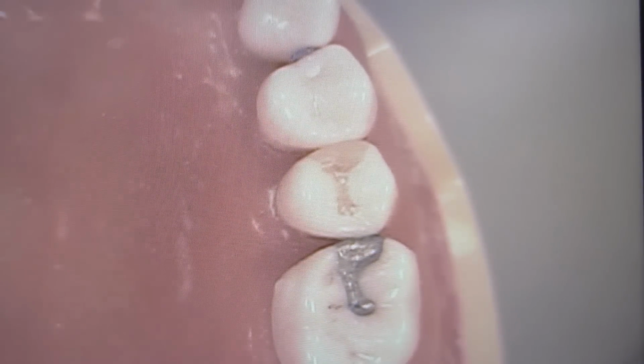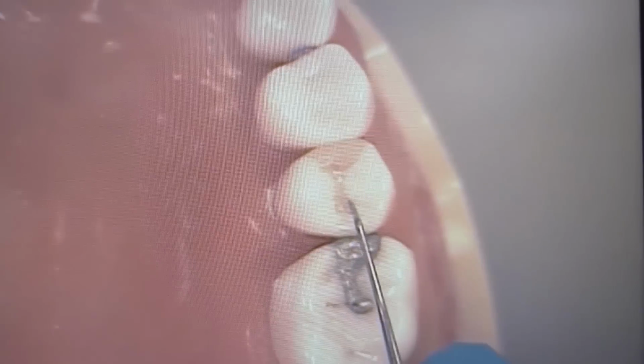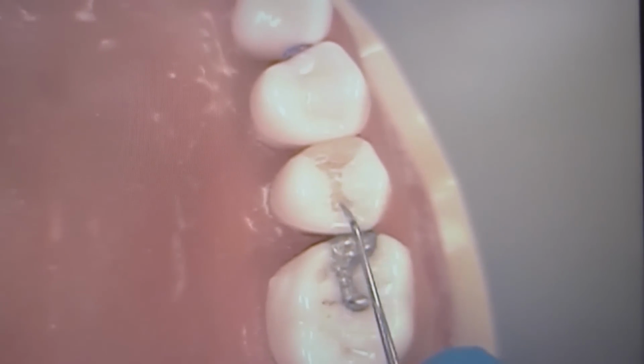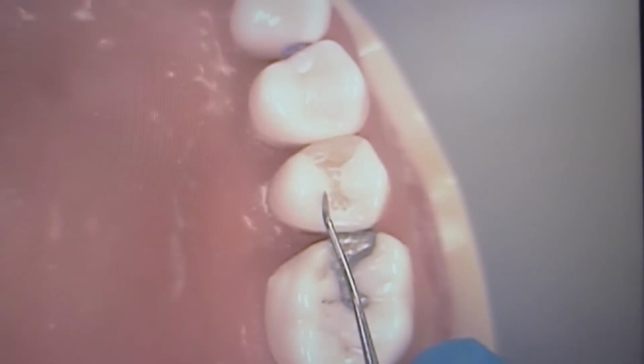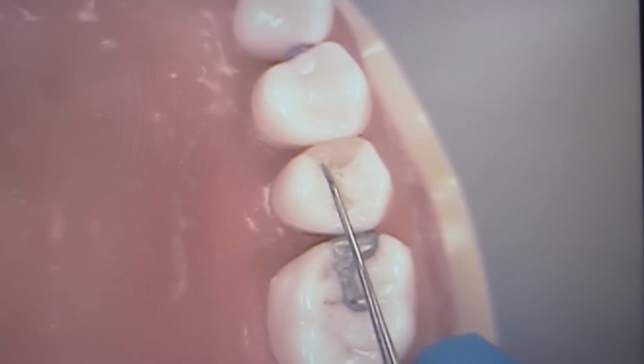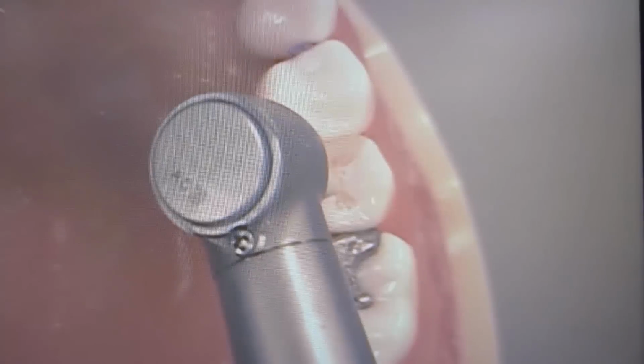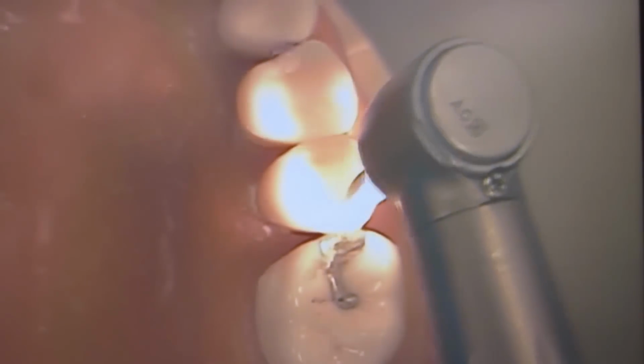So how do you know you have to use the white stone to smooth it out? You're going to use the white stone if you feel that your margins aren't completely flush with the tooth surface. I have a little bit of excess here. If you feel a little bit of excess in that area, use the white stone to smooth it out and make it continuous with the original tooth.